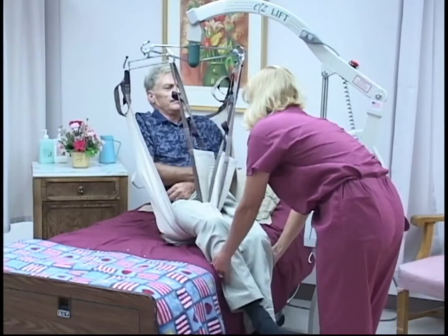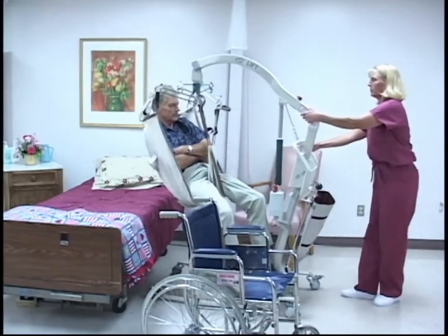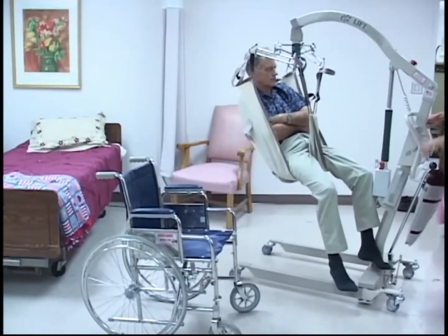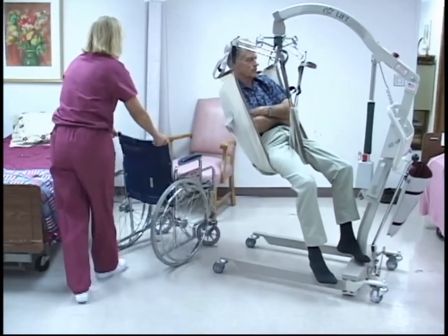Lift the patient's knees and smooth out the sling under the thighs. Then, continue lifting the patient to the desired height. There may be instances when patients with extremely fragile skin will require a different sling, such as a multi-purpose sling.